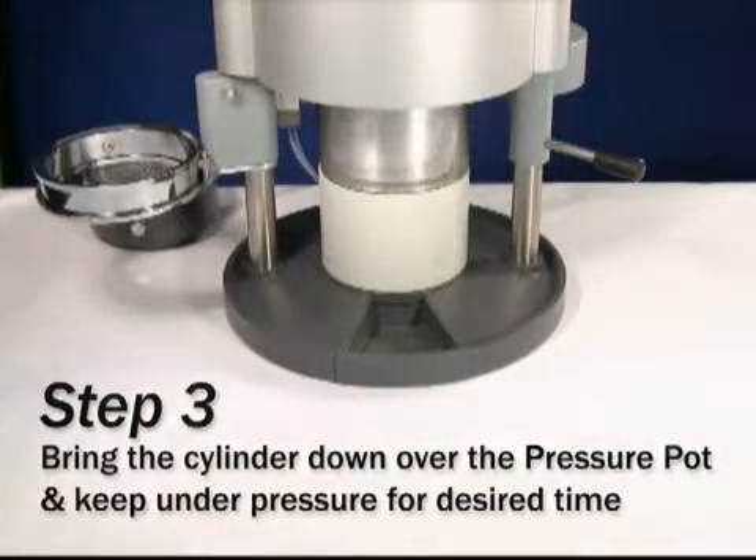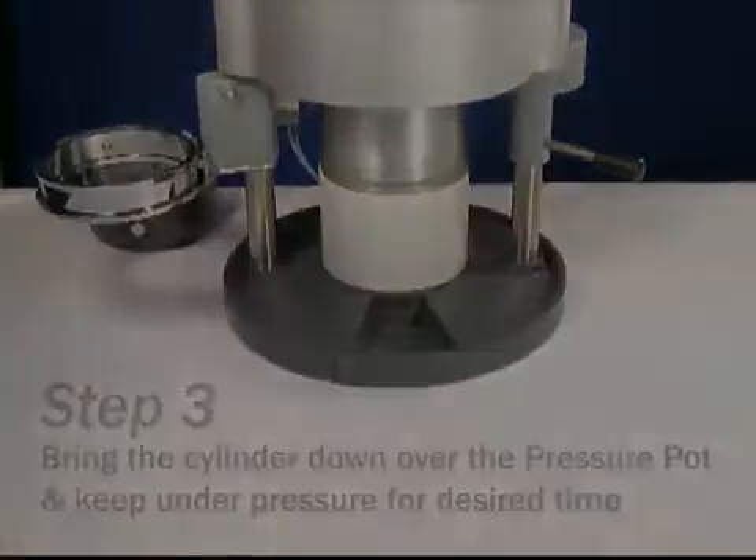Keep under pressure for the desired length of time. This time will be determined by the operator and the appliance they are working with. Using the arrows on the panel at the top of the drufomat scan, you can control the amount of pressure needed to cure the appliance. Adjust to the desired pressure level.